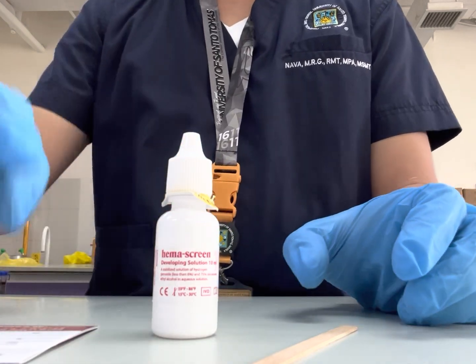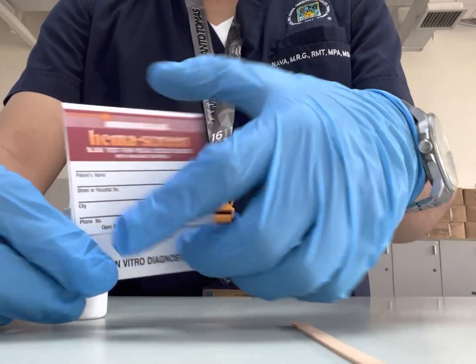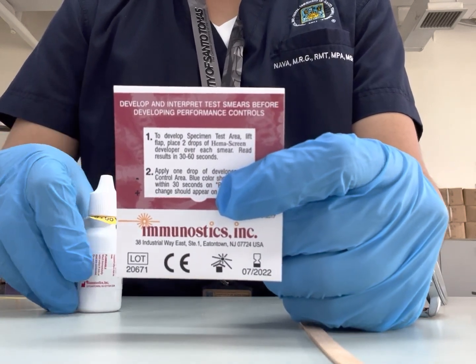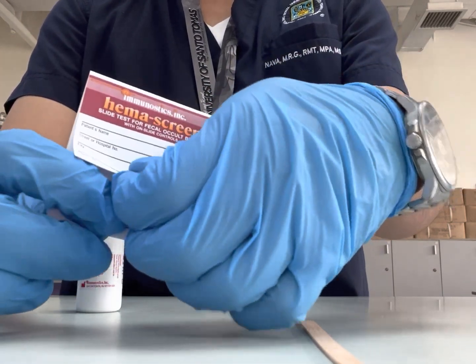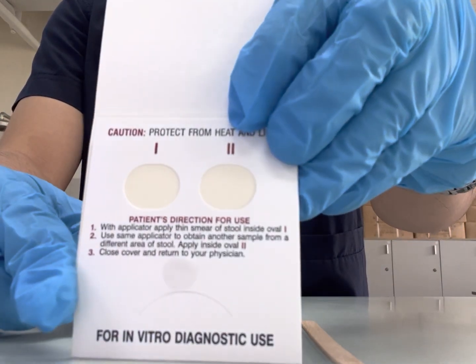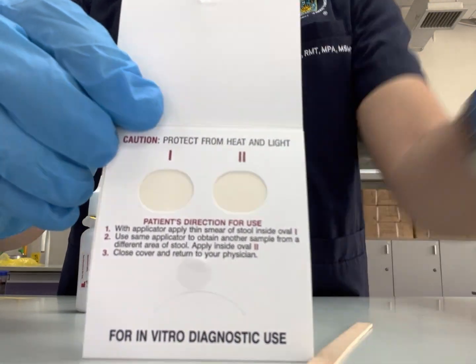Let us begin the testing process. This is the test card — it has a front and a back side. The back side is the testing area where we add the developer, and on the front side, this is where we swab our stool sample. Open the front flap to reveal the sampling area, labeled Roman numeral number 1 and Roman numeral number 2. This is where we swab our stool sample.